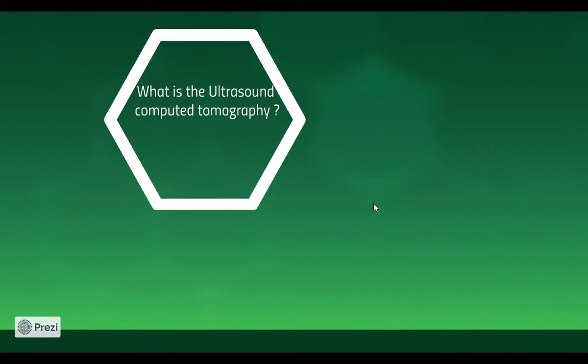What is ultrasound computed tomography? Ultrasound computed tomography is a form of medical imaging utilizing ultrasound waves as a physical phenomenon for imaging. It's mostly used for soft tissue medical imaging, especially breast imaging, and next we're going to see why it's especially used for breast imaging.